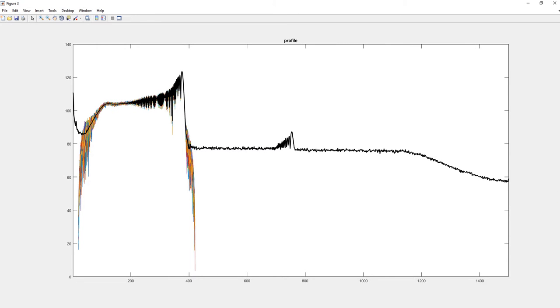For this depth profile, we have to set some parameters. We need to check the peak. For the peak detection, we have to select an initial range. We can select our initial peak range here, from 50 on the x-axis to, say, 600 or 700, whatever. Then we have to select an SNR threshold. Say the SNR threshold for the peak detection is 88, and on the right side we can select the same type, 88, 87, whatever you select. These are important.